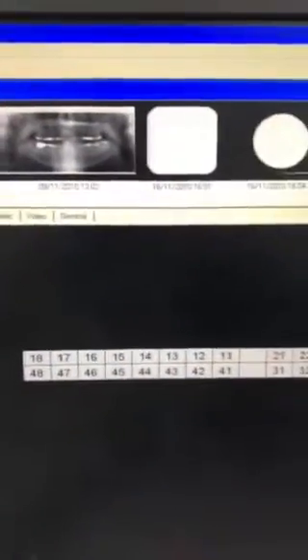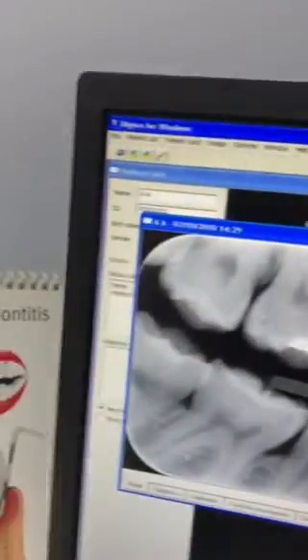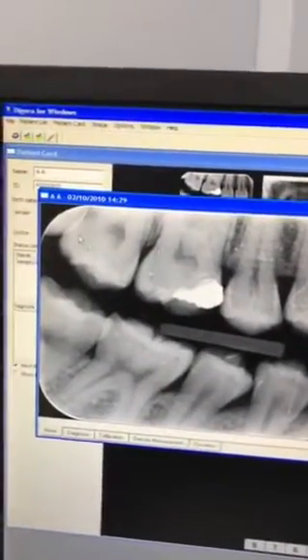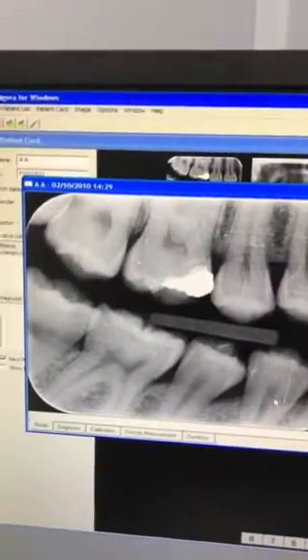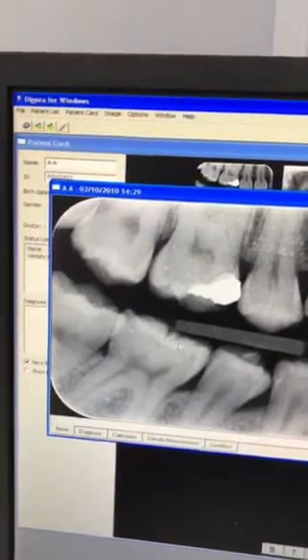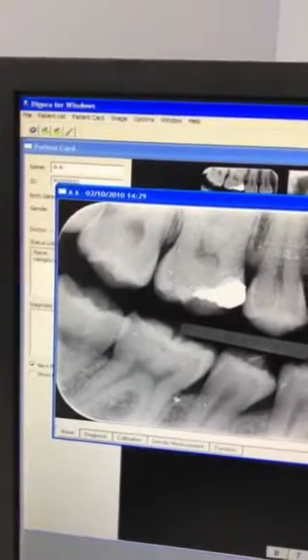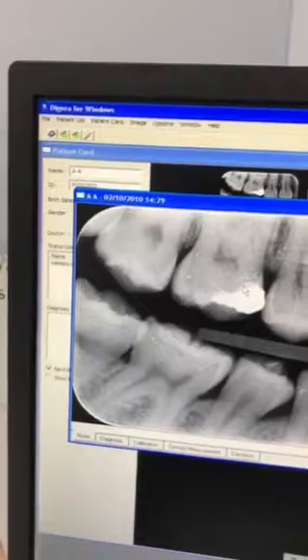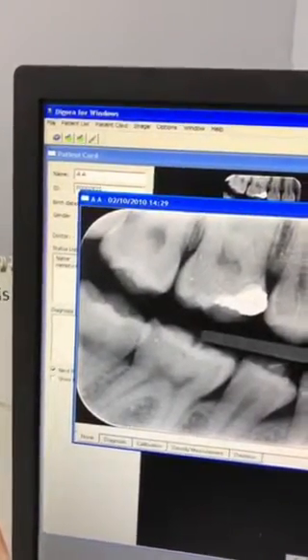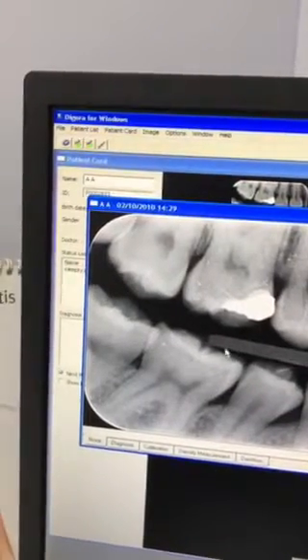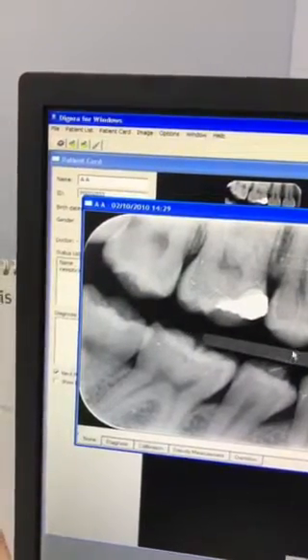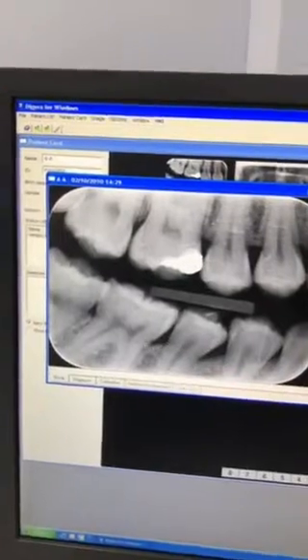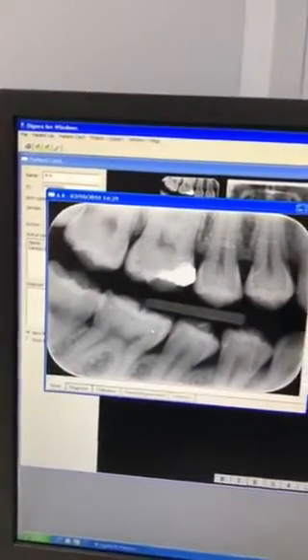This particular image is called a bitewing X-ray. In a bitewing X-ray you can see the back teeth and the teeth a little further forward. You can identify the enamel around the tooth, the nerve within the tooth, the bone around the tooth, and any silver-coloured fillings. You can also see contrast, grey shadows, and dark areas, as well as the holder that the patient was biting on to keep the X-ray stable. The image is magnified, allowing us to see better what's going on around the teeth.